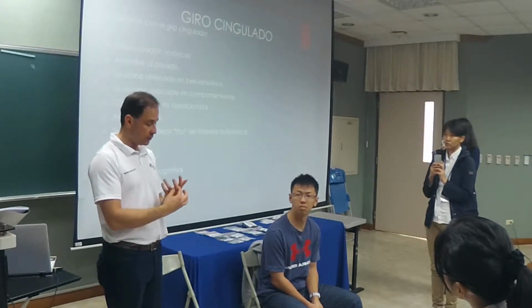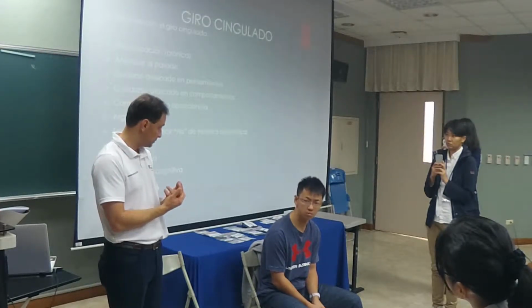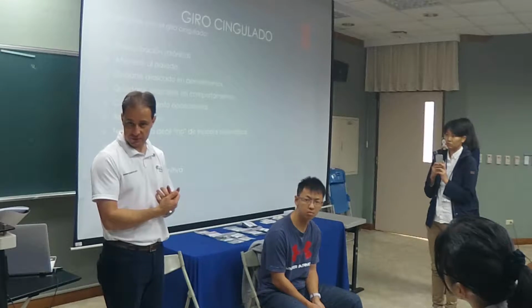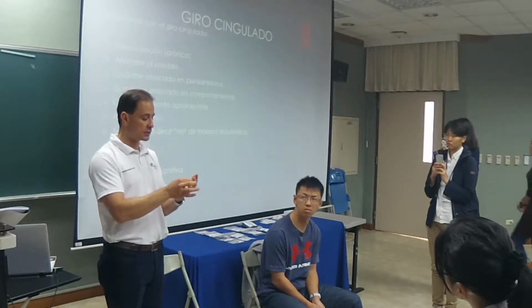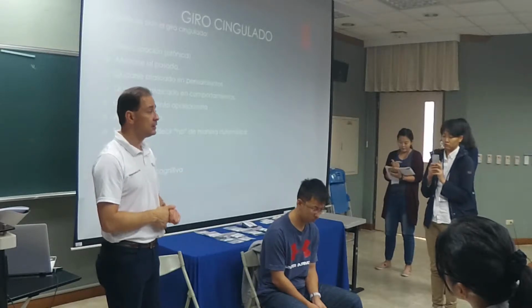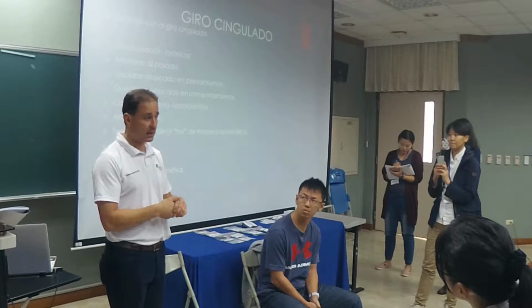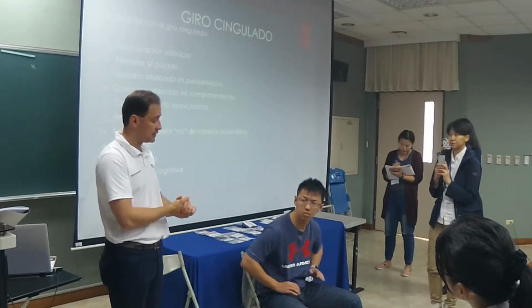Then we do what we call the stress 2 phase. So we stress him again, and then the recovery 2 phase. So it's baseline, 1 stress, 1 recovery, 1 stress, and 1 recovery. And that's it. And then we proceed with the interpretation and the assessment and the feedback to the client.